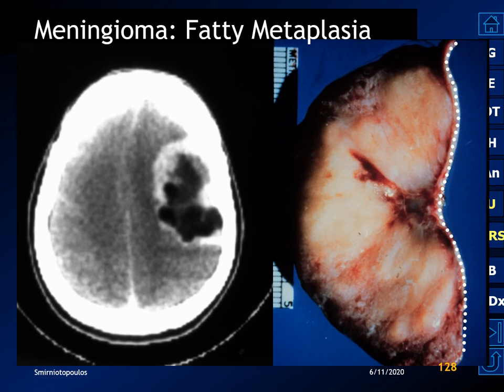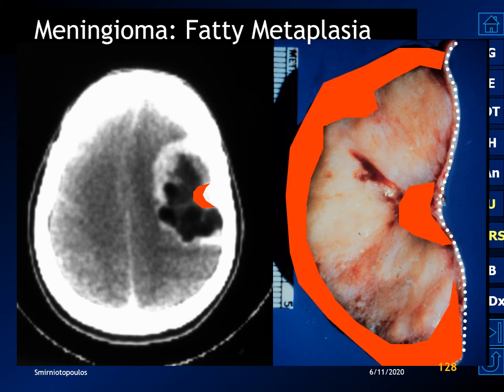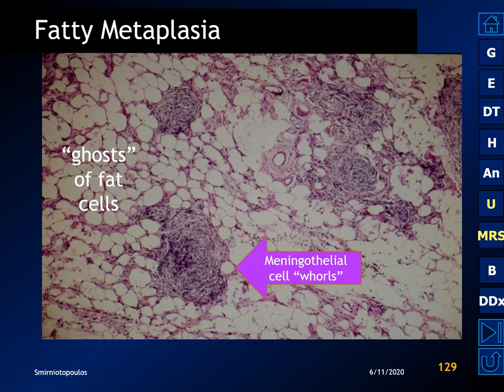The dura is not infiltrated by the tumor and has normal thickness. The histology shows classic meningothelial whorls indicating meningioma, but in between we can also see cells with a large amount of intracellular triglyceride — the fatty metaplasia that causes the CT appearance.